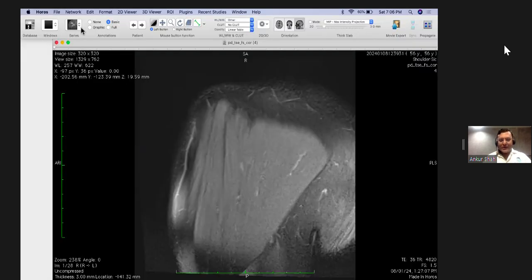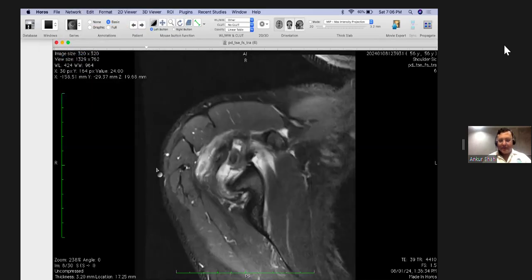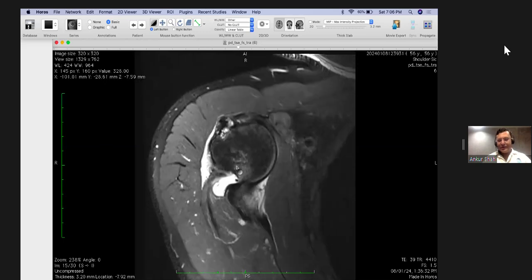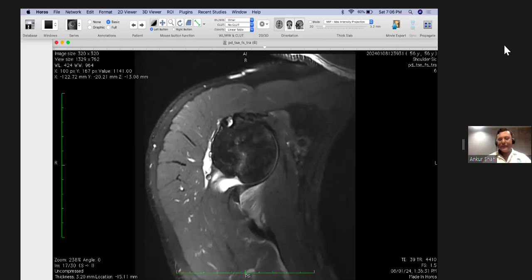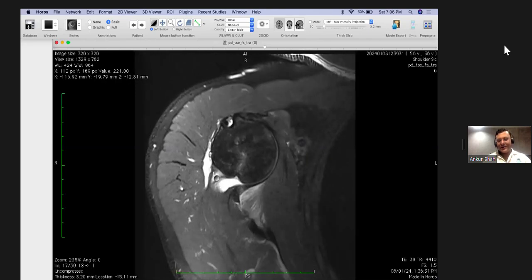So shoulder dislocations sometimes present in a very bad way, where it is very obvious, like here. You can see the shoulder is dislocated, even impacted. The humerus is displaced anteroinferiorly, and there is an impaction of the head of the humerus with the glenoid. But every time it doesn't present in this way.